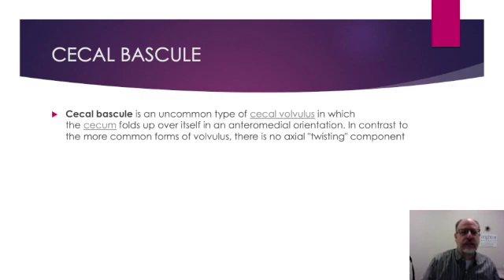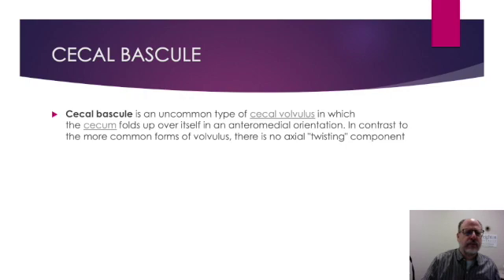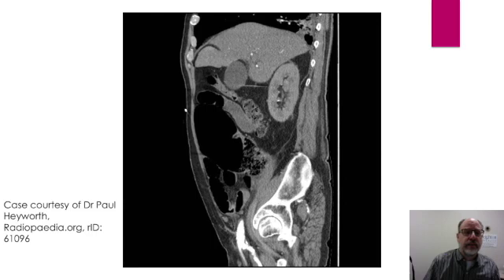Another less common type of cecal volvulus is termed the cecum bascule, in which the cecum folds up over itself into an anteromedial location. In contrast to the more common type of volvulus, there is no twisting component. This is often an intermittent finding, also called a mobile cecum, and can cause intermittent obstruction. A sagittal CT image shows a dilated loop of cecum in the anterior aspect of the abdomen projecting towards the right upper quadrant adjacent to the gallbladder. The cecum is mildly dilated, but there is no twisting as is typically seen with a cecal volvulus.